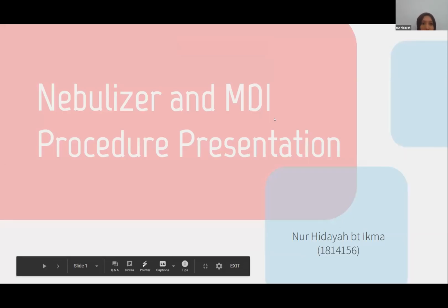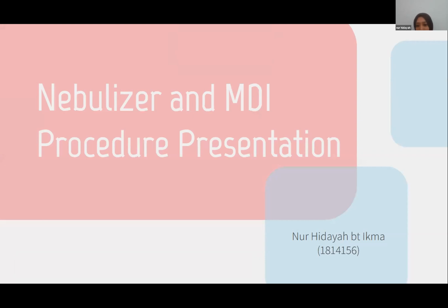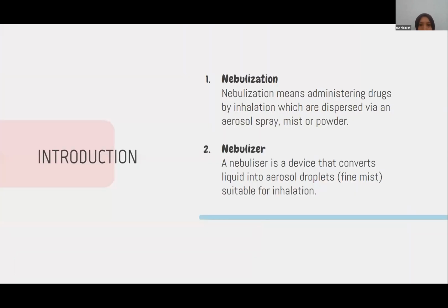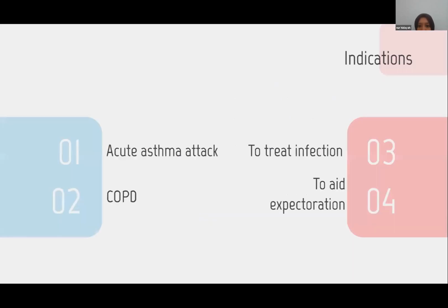Assalamualaikum warahmatullahi wabarakatuh. My name is Nur Hidayah binti Ikma and I will present to you about nebulizer and MDI procedure presentation. So first I will present about the nebulizer. So what is nebulization? Nebulization means administering drugs by inhalation which are dispersed via an aerosol spray, mist or powder. And nebulizer is a device that converts liquid into aerosol droplets suitable for inhalation.